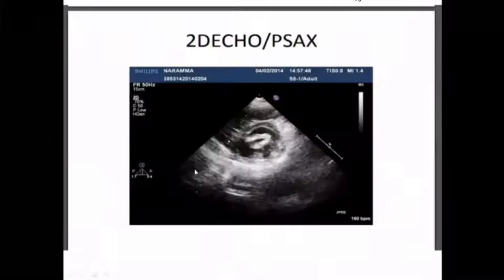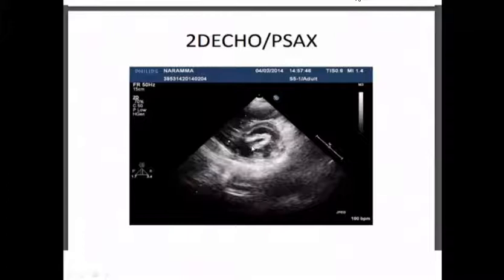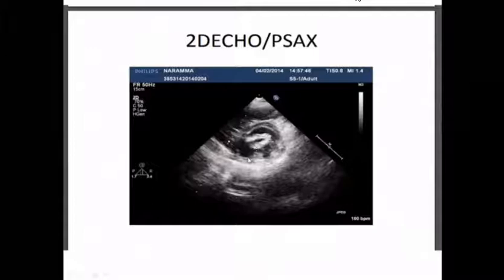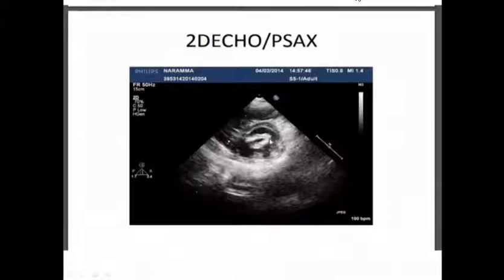The parasternal short-axis view requires the transducer to be perpendicular to the mitral valve for a proper view. This view takes more time and practice for beginners. Once achieved, planimetric measurement of the mitral valve area can be performed. You can visualize the medial and lateral commissures — for example, the lateral commissure may be fused while the medial commissure is free, with thickening at the tips of the valve.